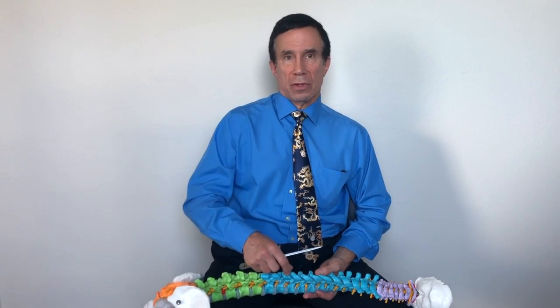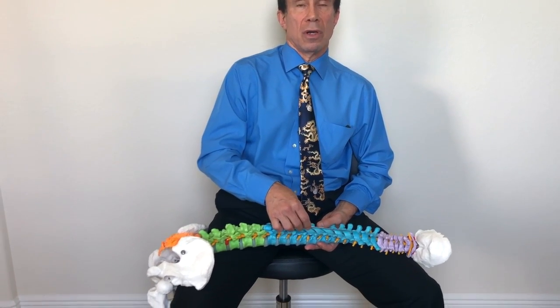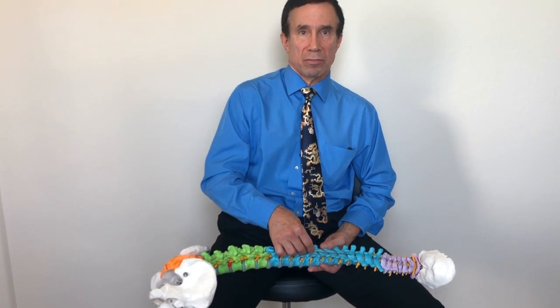The removal of electrodes and tape is done quickly and easily, and then a decision needs to be reached as to whether the patient received enough relief to justify an implant. This is a highly individual decision, but typically we like to see at least 50% pain relief. In my practice, about 90% of such patients experience enough relief that they wish to go on for a permanent implant. A permanent implant is done typically by a neurosurgeon.